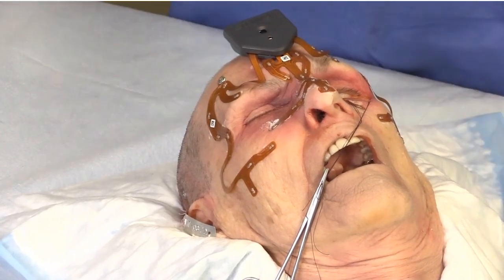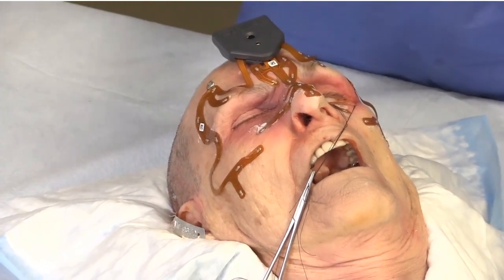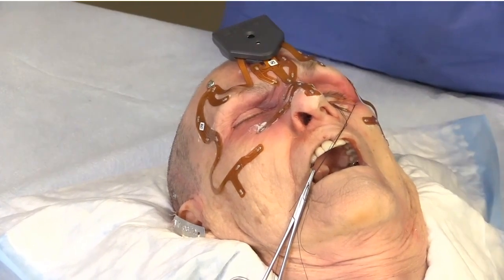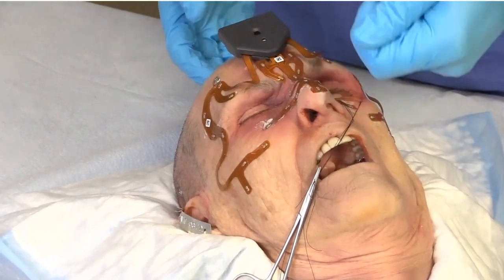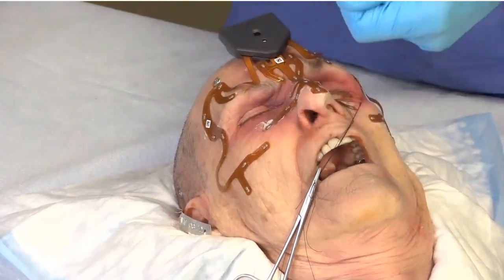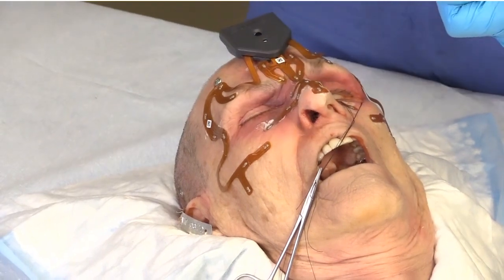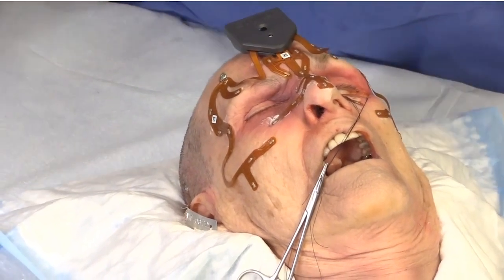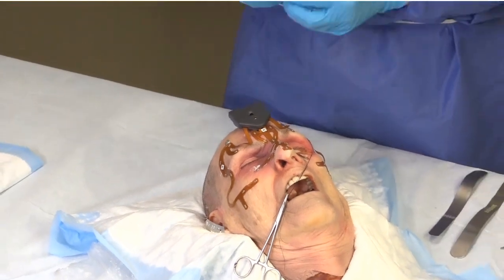What would preclude you from using the mask for tracking is a coronal flap. A coronal flap brings the skin forward up and over the structure, which would obscure the LED lights from the eye, so you wouldn't be able to use it. In those instances, you're better off using the skull post.